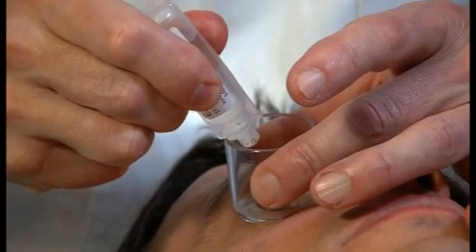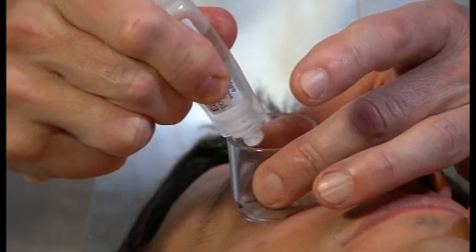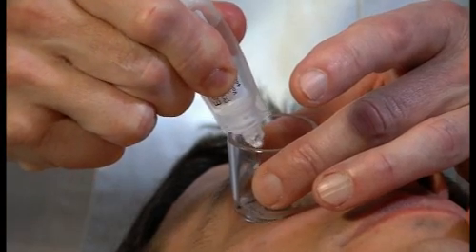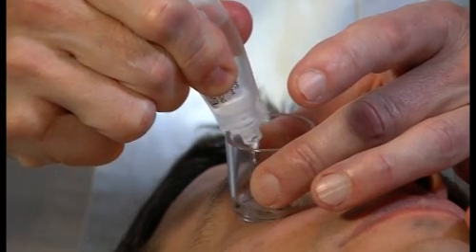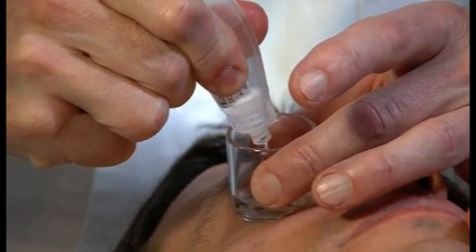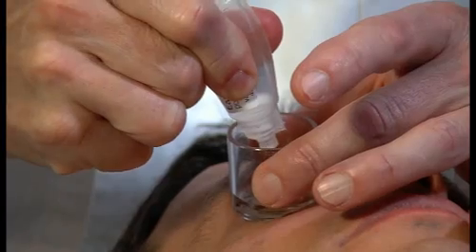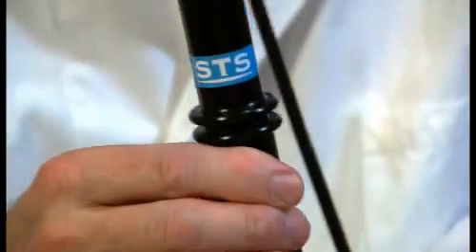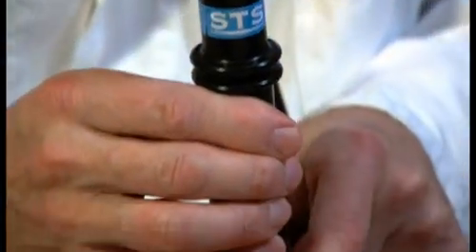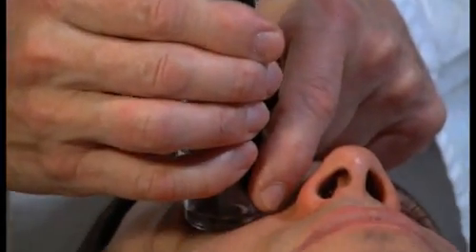The operator then fills the shell with physiological saline solution. The probe is placed in the shell.